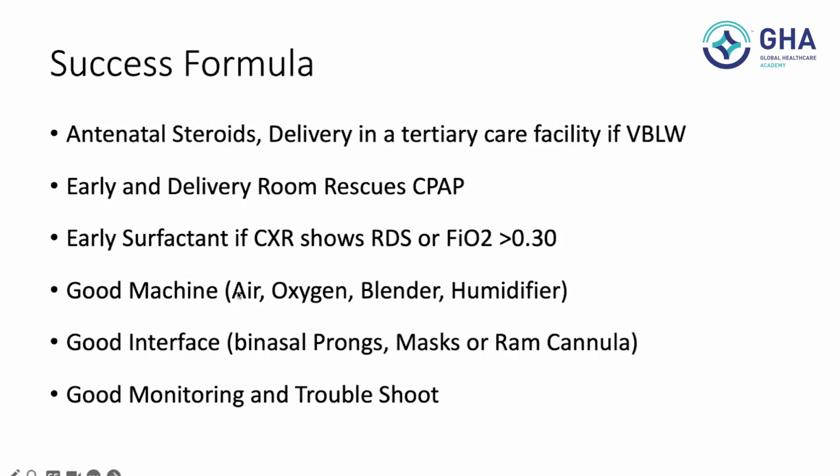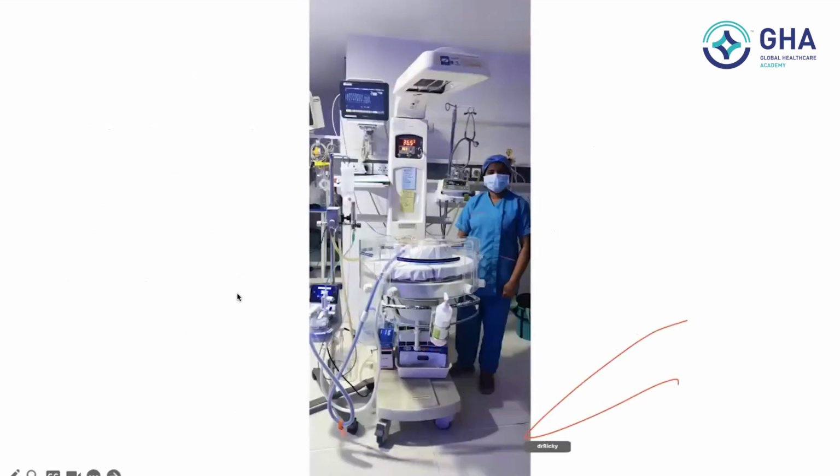And I would end by saying, more than all this, the most important is the person standing by the baby, that is the nurse. So the nurses have a huge role in improving the success of CPAP, because CPAP is done most of the time by the nurses. They know how to start CPAP, how to monitor, how do we say that CPAP is not successful, how do we ensure that the interface is fixed properly. And that is why the success of CPAP is nurses, and nurses training is very important to ensure that most of these babies are not going for nasal IMV or ventilation.